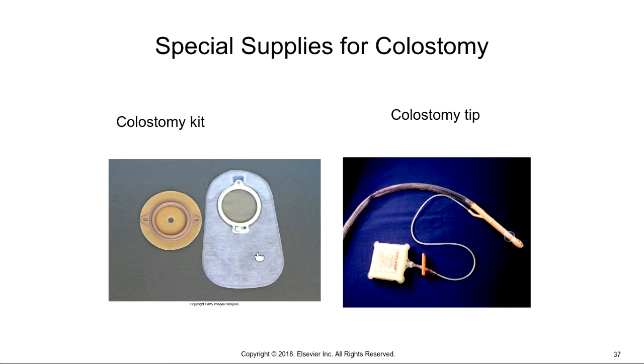They apologize up and down for the smell, but you have to be very matter of fact and not allow them to feel embarrassed or feel bad about having this colostomy. You have to act like this is a normal everyday thing, and this is typically what you deal with on a daily basis.